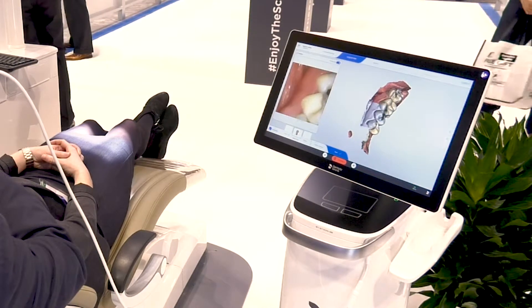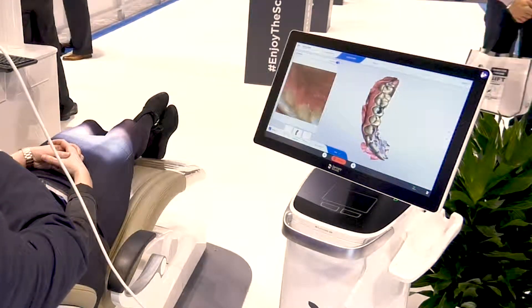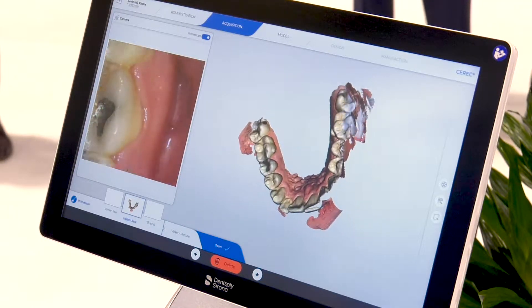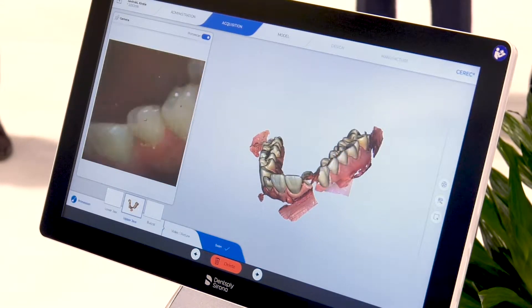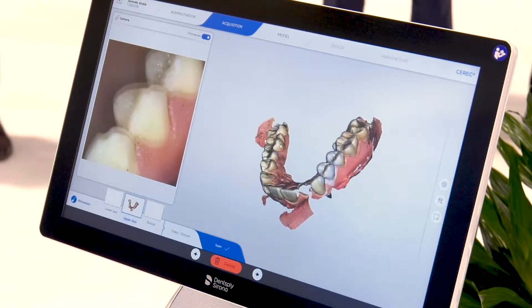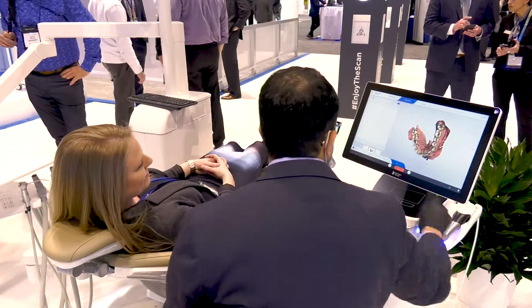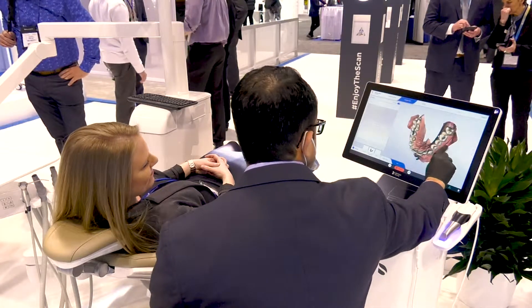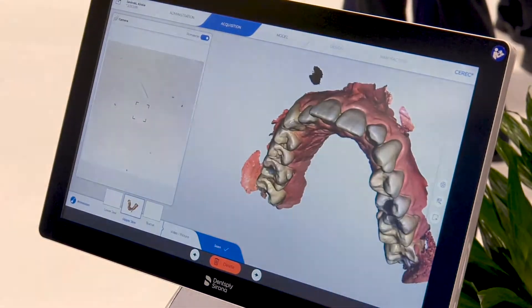We've got auto artifact removal built into the unit, so as artifacts are picked up while the doctor is scanning they're automatically removed. PrimeScan can also pick up soft tissue easily — in 45 to 60 seconds we've got a full arch impression that we can use to send out for clear aligner therapy, orthodontic treatment, or maybe this patient needs a sleep appliance. The touchscreen allows us to check the scan and make sure we have all the information we need. Once the doctor is happy, they can move forward to the next step — quick processing and ready to send to the lab.